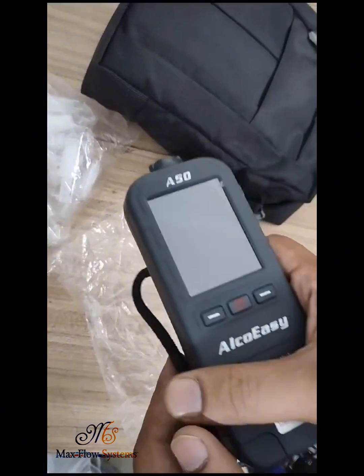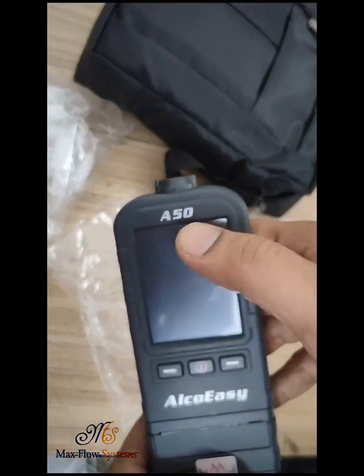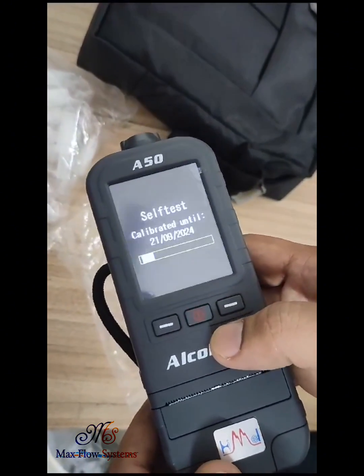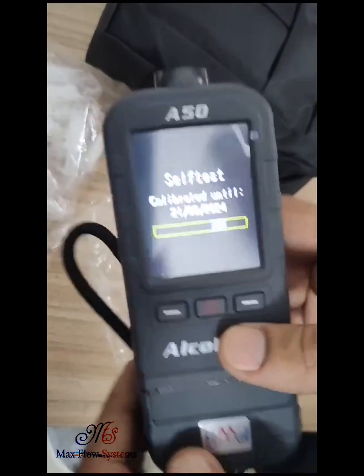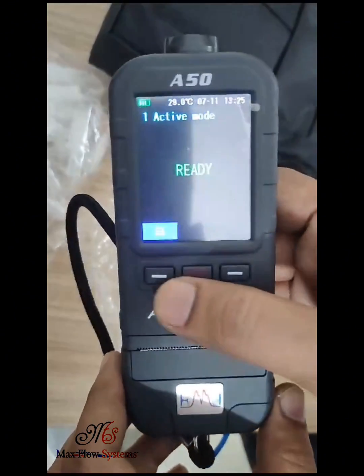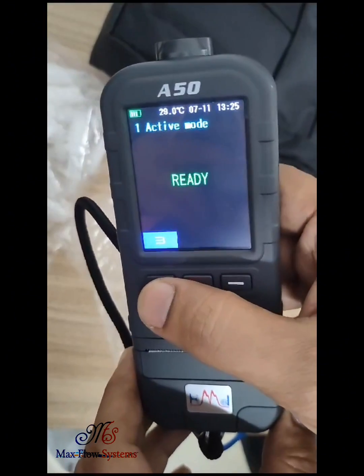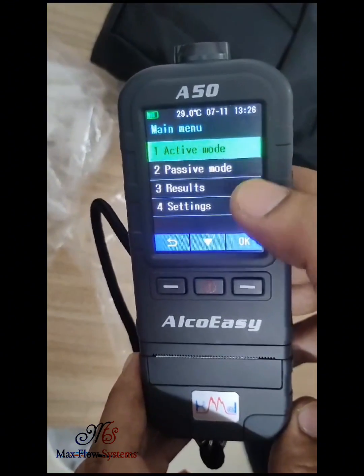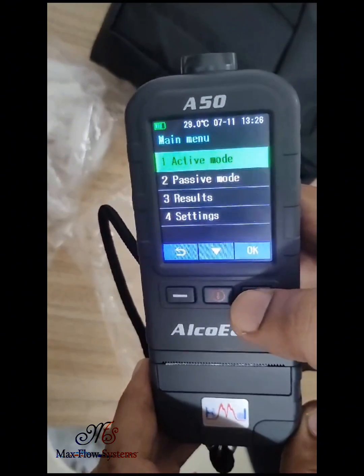Now I will show you how to use the alcohol tester, model number A50. You have to press this button, then click on that button. The menu shows active mode, passive mode, results, and settings. You have to click on active mode.